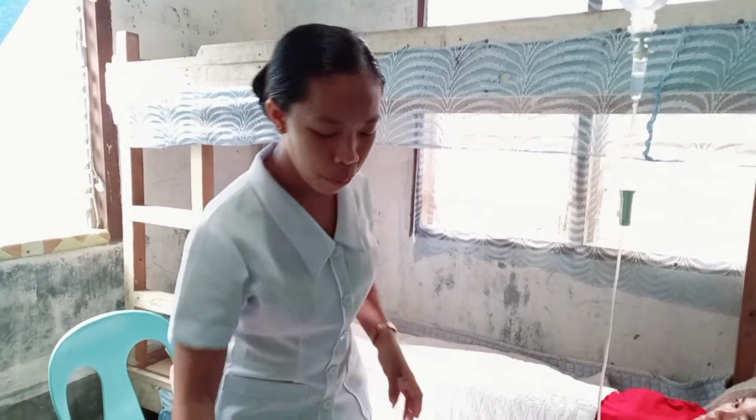So make sure that we have the medication ticket that has the doctor's order that says we can now remove the IV line. This is to prevent inadvertently removing the IVF and having to reinsert it. Next, we will wash our hands and assemble the equipment. Assuming that I already washed my hands and assembled the equipment, and then identify the patient and explain the procedure. Assuming again that I already identified and explained the procedure, we will now proceed with the procedure.